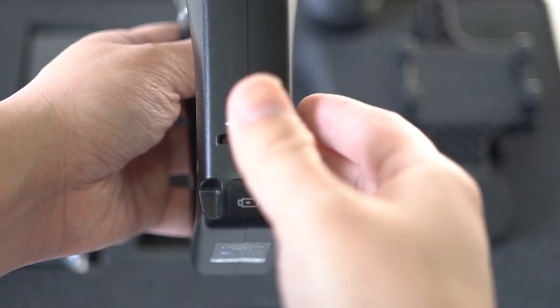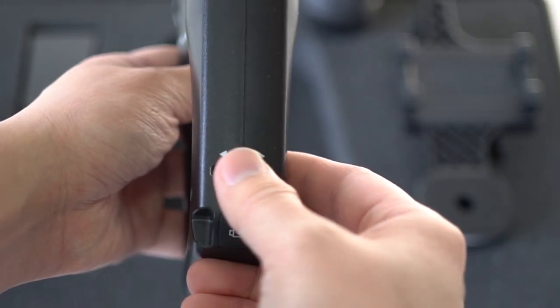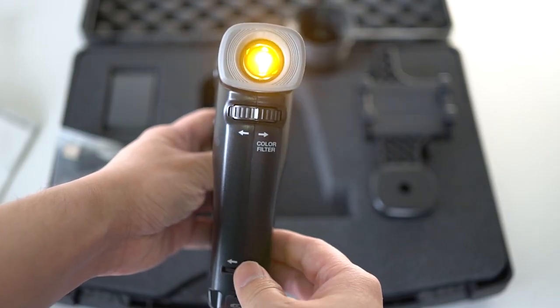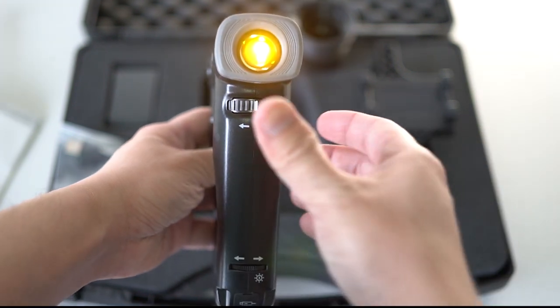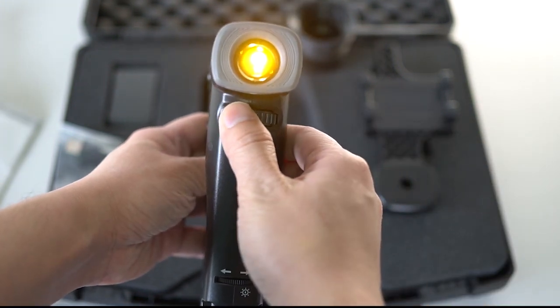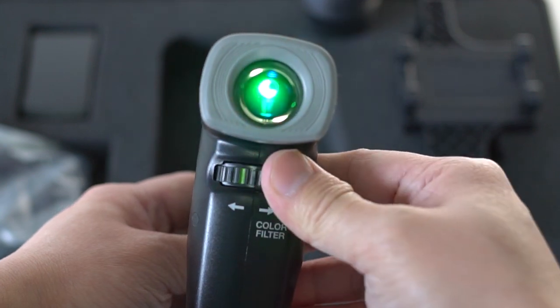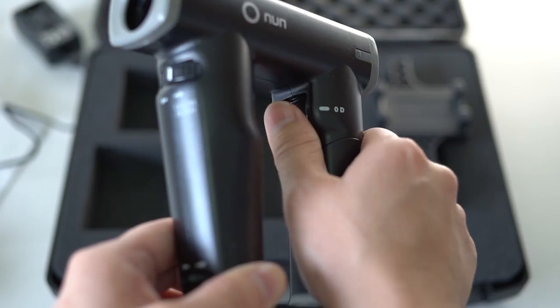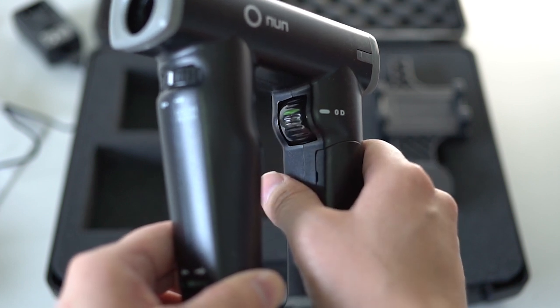To turn on the ophthalmoscope, rotate the illumination wheel at the bottom front of the handle. You can also control the brightness of the illumination using the same wheel. You can switch between the filters — yellow, red free, or cobalt blue. The focus wheel should be set at green for neutral refraction.